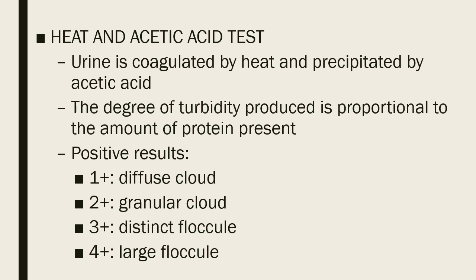As we talked about in your biochemistry, pure proteins are complex three-dimensional structures stabilized by various chemical bonds and interactions. When you apply heat to a protein, it will destroy the three-dimensional structure, or the structural arrangement, of your protein. This causes destruction of its native conformation and leads to denaturation of the protein. After the protein is denatured, the protein molecules will undergo coagulation or precipitation. The addition of acetic acid during this testing will help in the coagulation process.